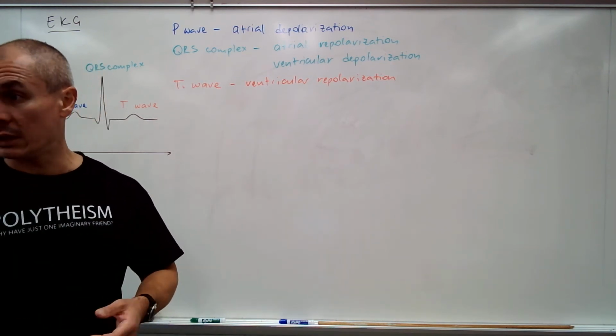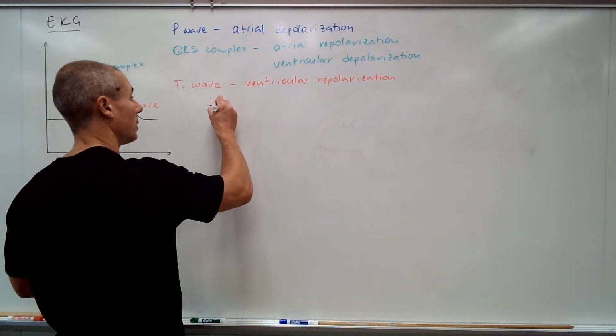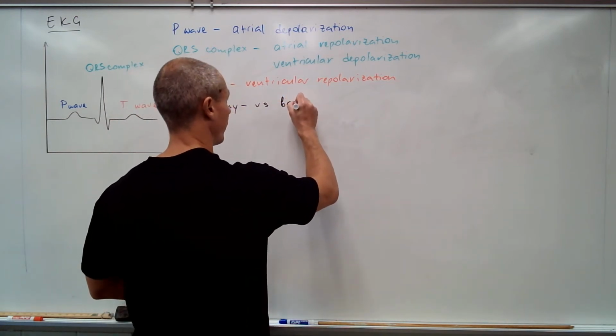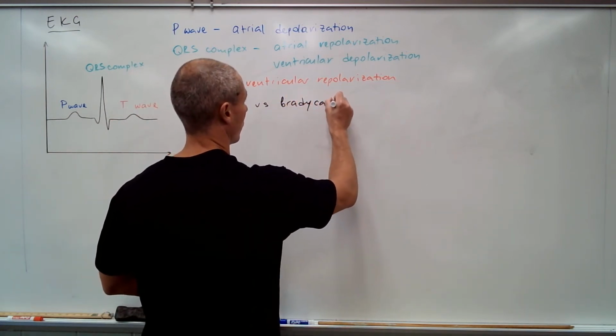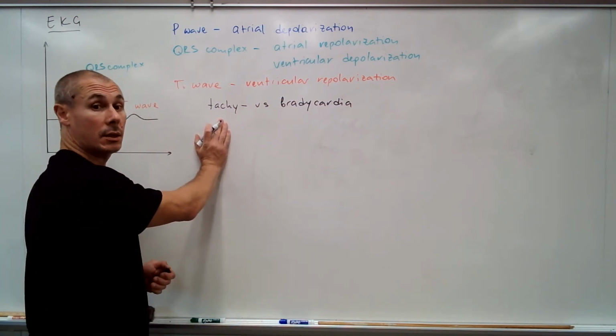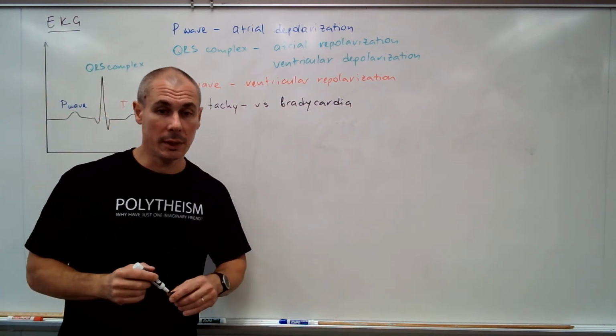So that brings us to several cardiac, well, I wouldn't say pathologies, but problems with EKG. And what can they tell you? For instance, first, tachycardia and bradycardia. Very fast contractions, very slow contractions. Now let me ask you this.